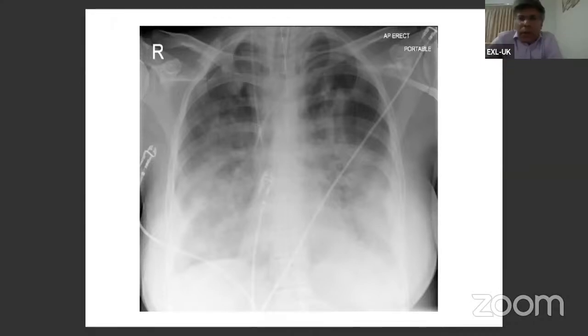Thank you very much, Dr. Afsar. You can see why we need radiologists to help us out, because these are the sort of things where, as clinicians, as physicians, we always have a doubt. And most of the time in the UK, it is the junior doctors who look at these confirmed placements, that's why it's so important. Next slide, please.